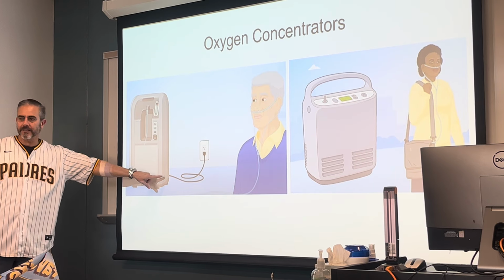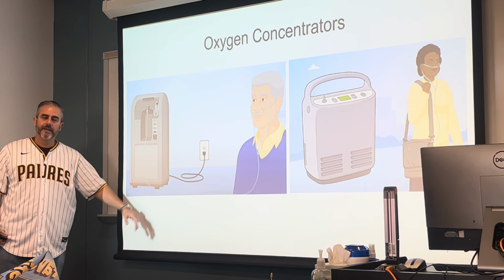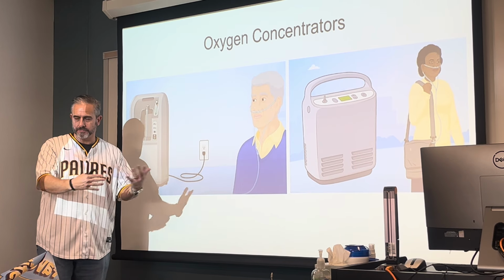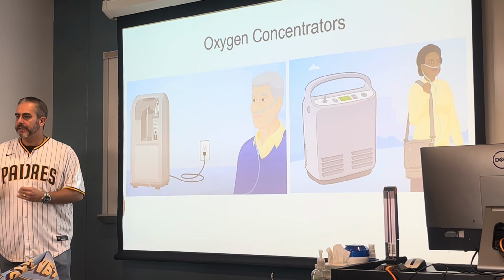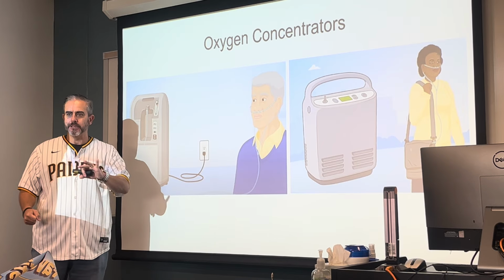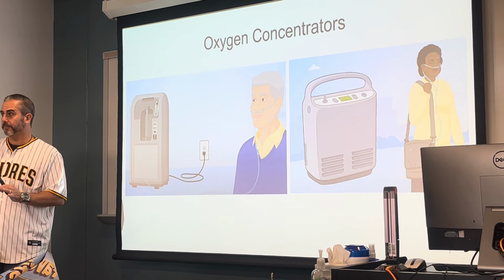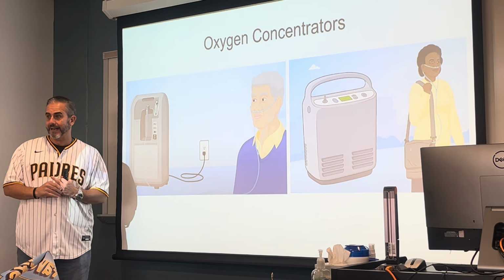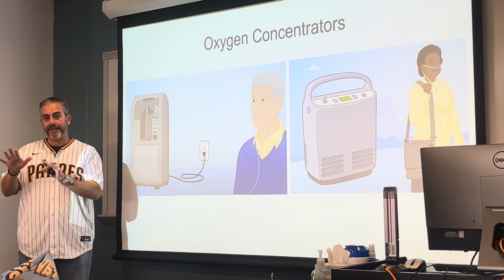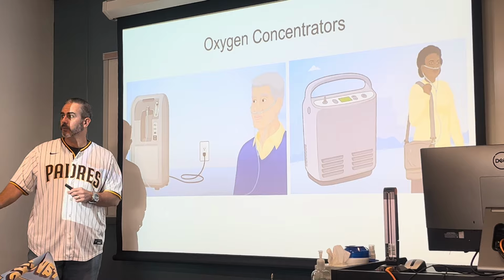But because this can't go very far beyond the electrical cord, if a patient's going to leave home, go out for the day, yes, they can bring an oxygen cylinder with them and do whatever they need to do, but the patient needs to understand that oxygen tank's not going to last forever. We'll teach the patients how to calculate how long that tank will last, or give them a general range or an idea that if you run it at this liter flow, this is how long this tank will last you.